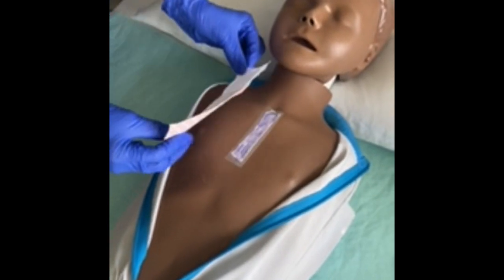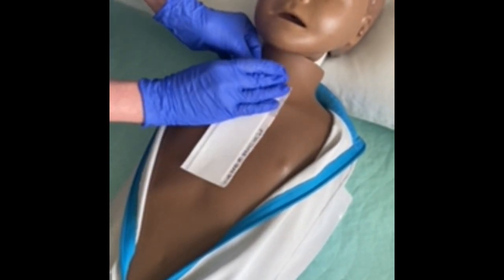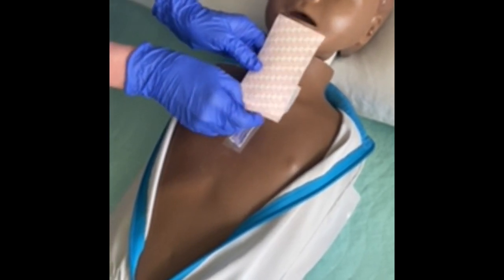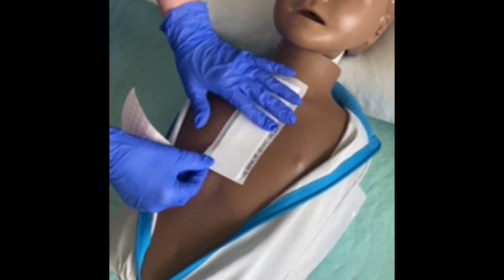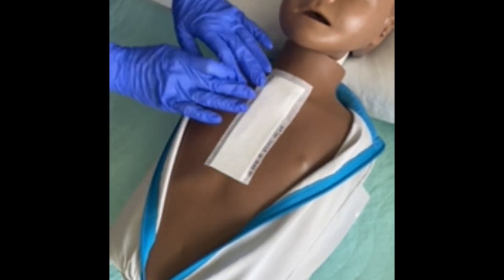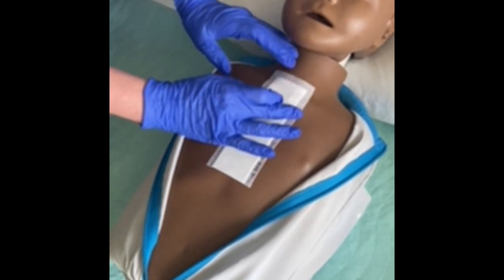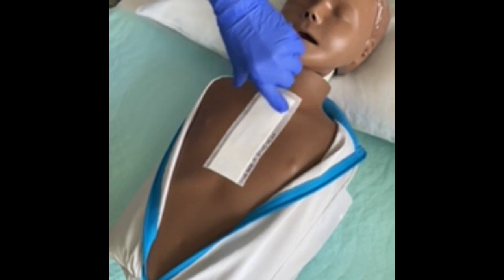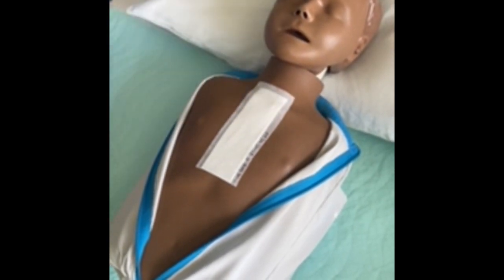Then once again, you're going to come up here. You're going to put it up. It's not going to hurt anything in this area for the drool. Then you're going to go ahead and pull the dressing down. And then you're going to have it there. So everything is secure. It's breathable on this end. And that's what we're looking for, so that either end is not compromised, and you want to line it up in the middle. So once again, none of the adhesive portion is getting on that Dermabond.